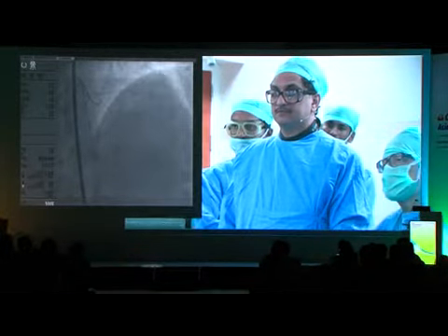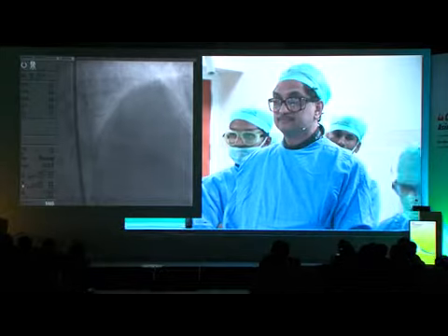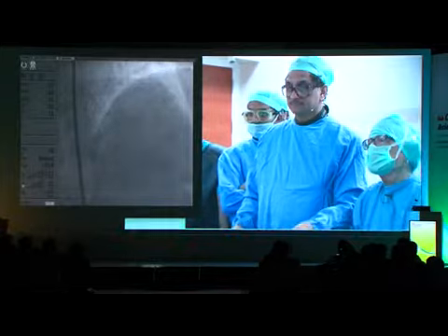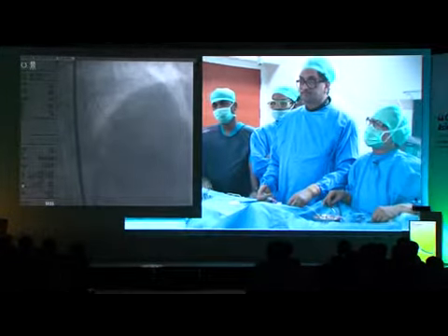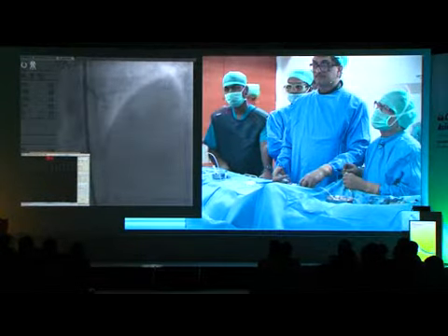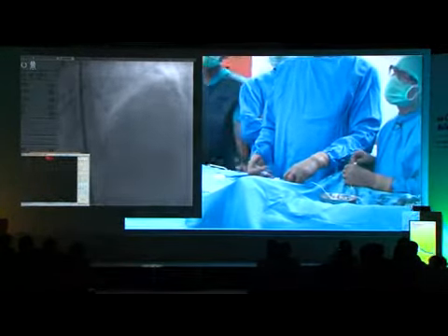It's always going in the same direction, which is probably right. You see the catheter is following well this time. What do you think is the direction of the guide wire? Where is it going? It's a little bit strange. Probably entering some diagonal. I'm sure that I'm somewhere. Maybe we can take back the other, softer one, because the catheter is more distal now.